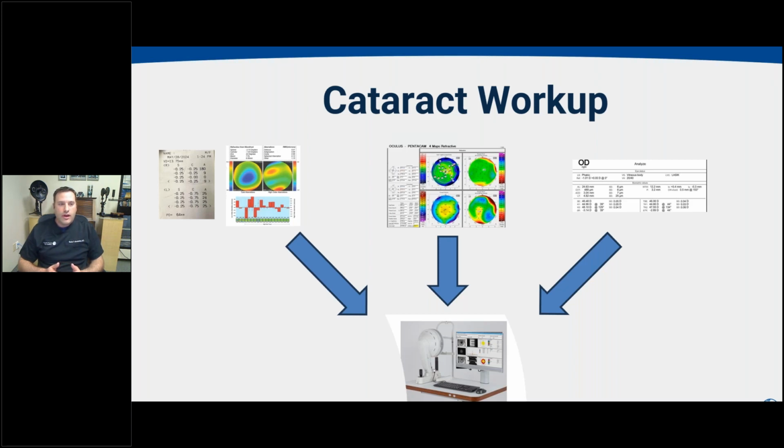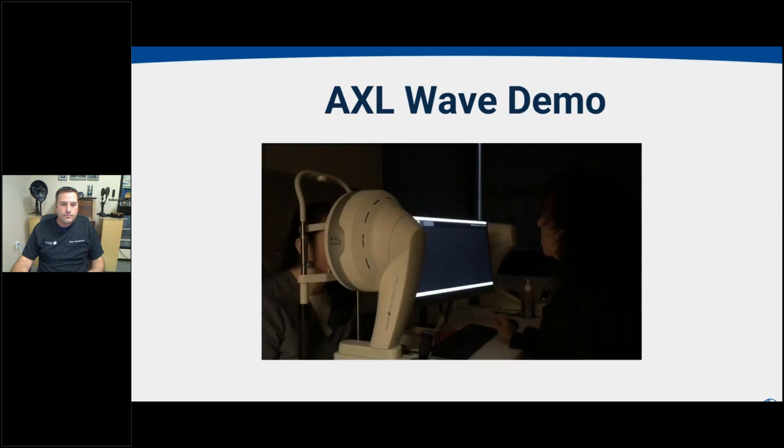So it's able to provide both corneal aberrations with internal aberrations, taking both the front and the back of the cornea into account, with autorefraction. It gives a full Scheimpflug tomography analysis of both the back and the front of the cornea, which particularly in refractive surgery and corneal surgery, we've become so dependent on, and I'm going to show tonight how I think it's very influential and helpful in cataract surgery. And it can also provide axial length measurements now as well, to really give you a very high level and comprehensive exam of the anterior segment before doing cataract surgery.